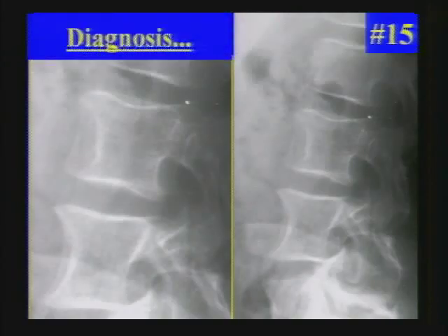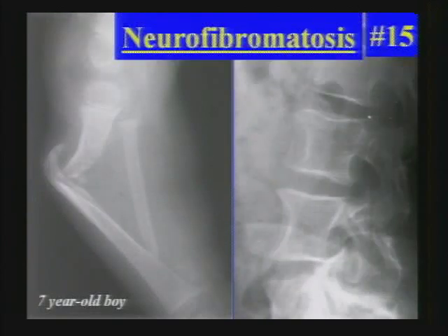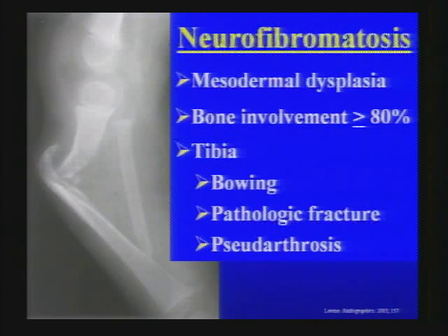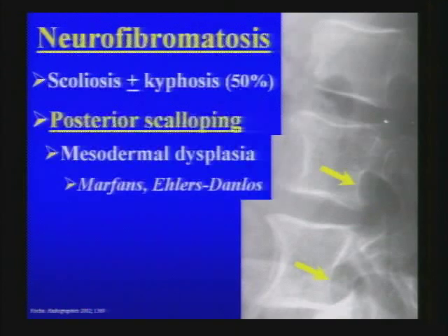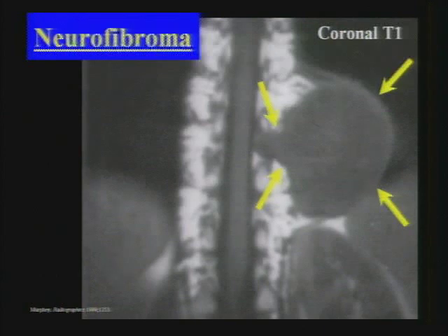Next case — neurofibromatosis. Here is an old image of the same patient as a seven-year-old boy. Neurofibromatosis is considered a mesodermal dysplasia involving bone in more than 80% of cases. When it affects the tibia, there is often early bowing, which may subsequently lead to a pathologic fracture that doesn't heal, resulting in pseudoarthrosis — considered characteristic. Spinal findings include posterior scalloping. In the differential for posterior vertebral body scalloping: other mesodermal dysplasias, dural ectasia, and a mass lesion. A neurofibroma can extend into the perivertebral soft tissue.